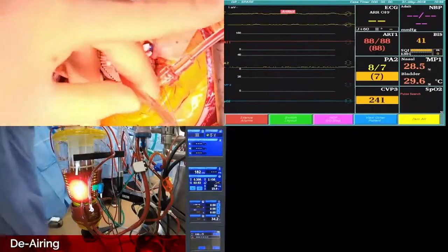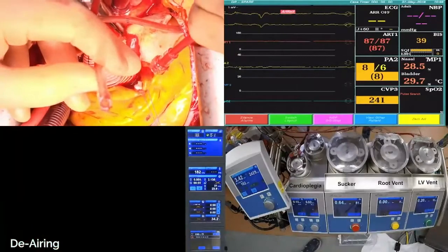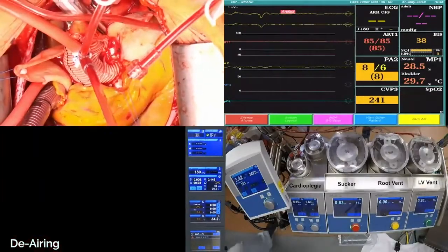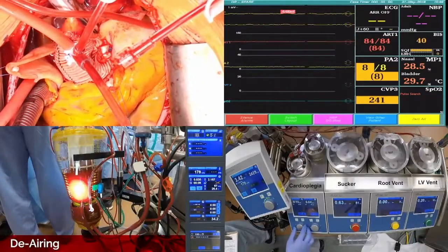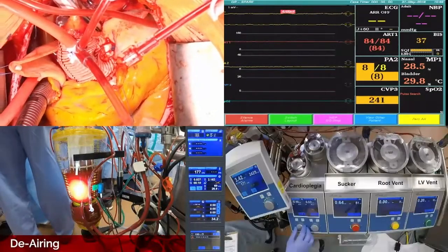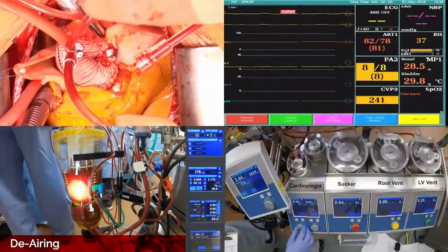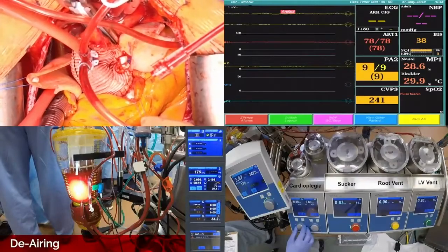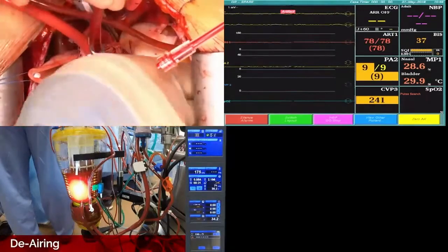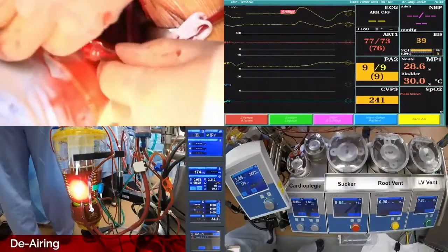It seems to work. You invented this. I'm sure there's a lot of guys that do this. Look, Mike's running it up. I'm trying to de-air. I'm trying to test the anastomoses, but mainly it's the de-air, I really want to get all the air out. You must be giving retrograde to fill right now, waiting for it to crack and come up through. There it goes. So now it comes up, and you're getting some air out there probably.